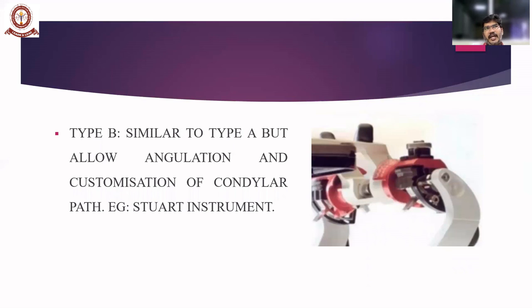Articulators play a major role in construction of any prosthesis, in complete dentures and any prosthesis in prosthodontics. It can be a simple removable partial denture, or a complex cast partial denture, or a fixed partial denture, full mouth rehabilitation, or even implant supported crowns.